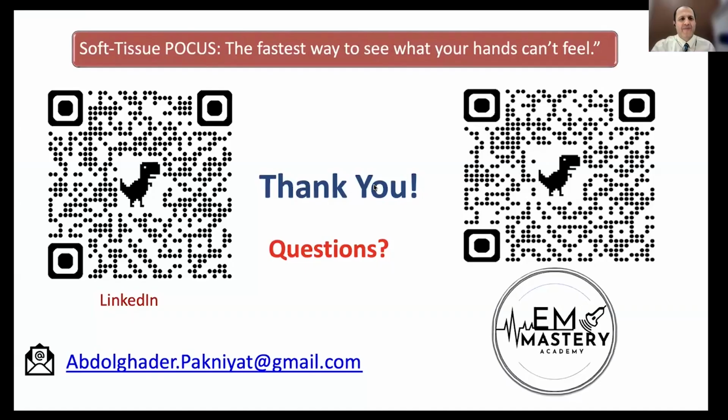All right. So first question: any experience in using elastography in identifying subtle foreign bodies?